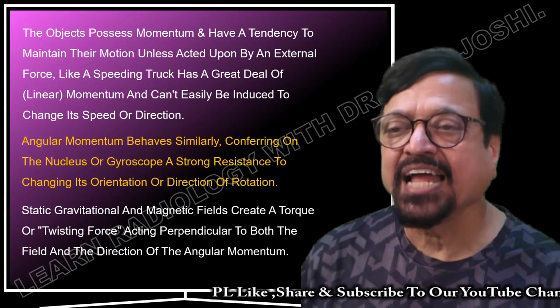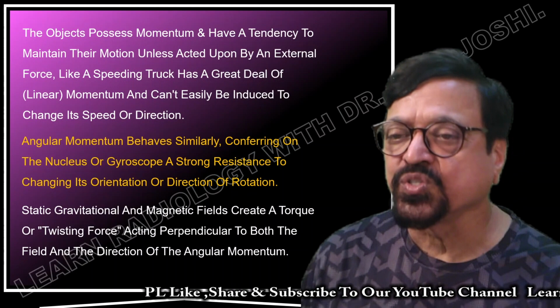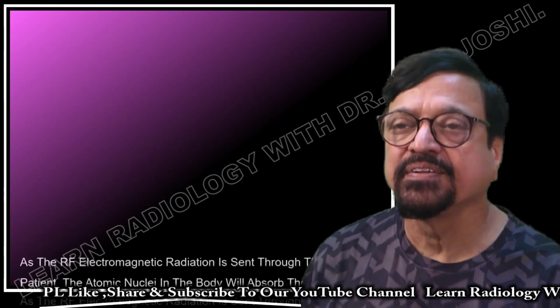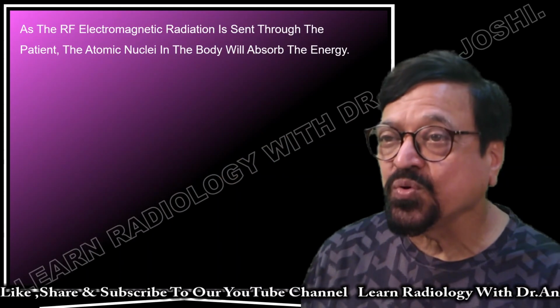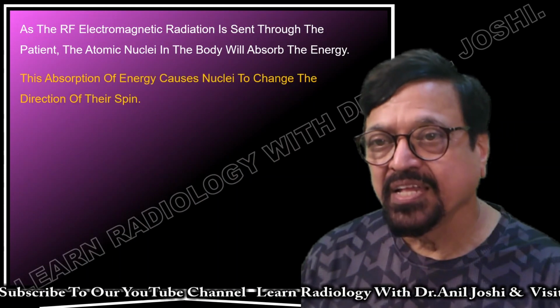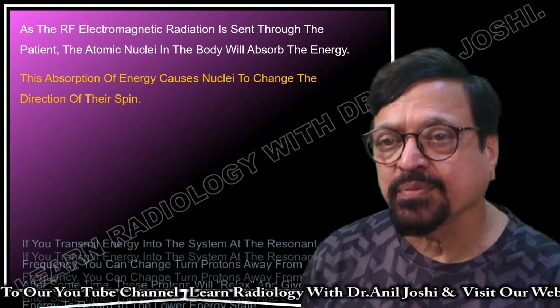Static gravitational and magnetic fields create a torque or twisting force acting perpendicular to both the field and the direction of the angular momentum. As the RF electromagnetic radiation is sent through the patient, the atomic nuclei in the body will absorb the energy. This absorption of energy causes nuclei to change the direction of the spin.